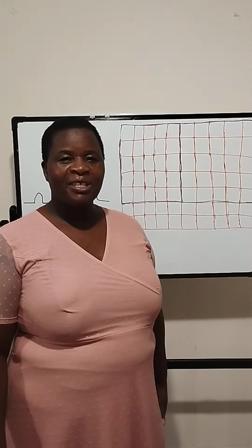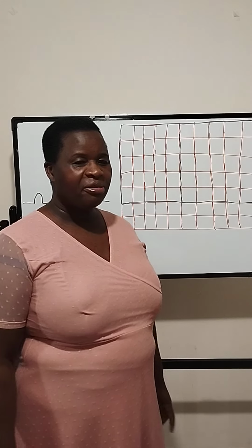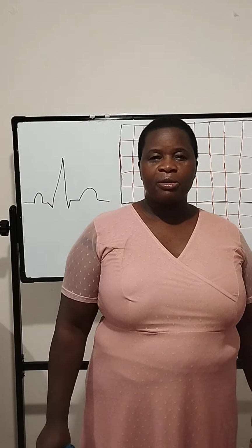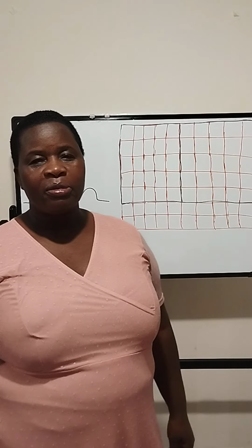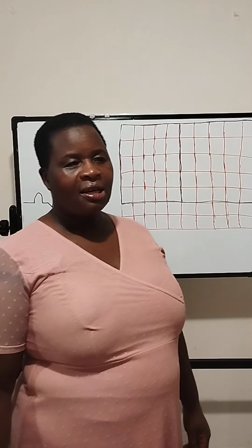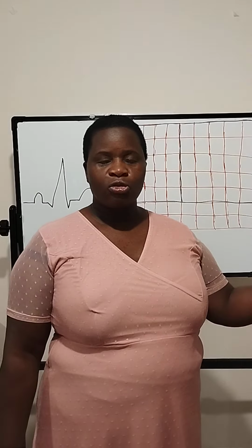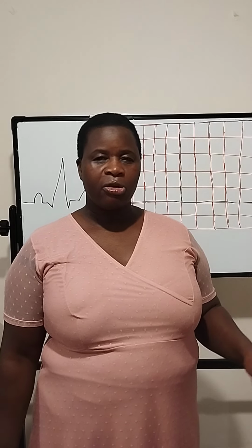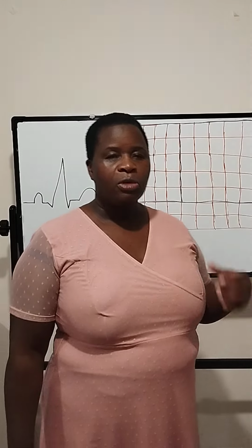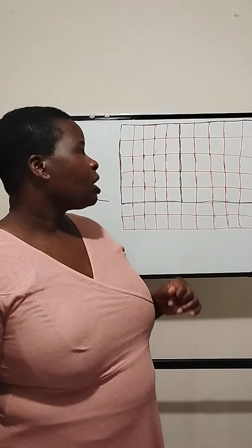Today I'm going to talk about the ECG like I promised previously. In my previous video, I talked about how to perform a 12-lead ECG, and I also talked about the cardiac conduction system of the heart. If you have gone through those videos, they will enhance your understanding of what I'm now going to talk about, which is called the ECG.